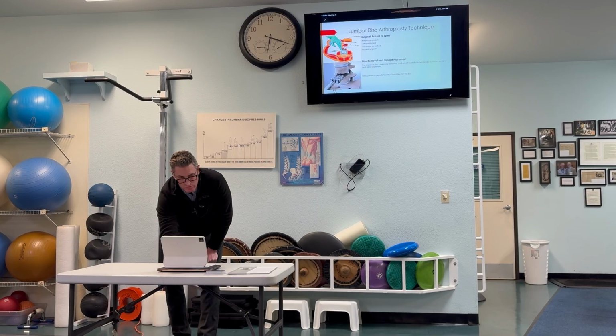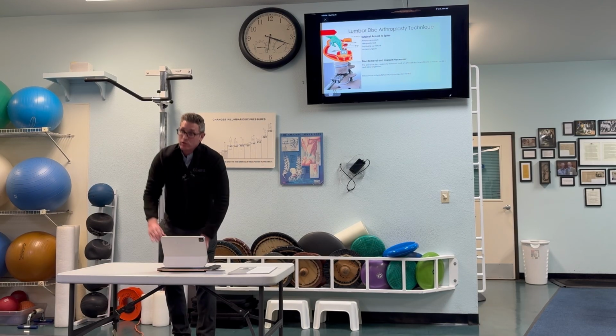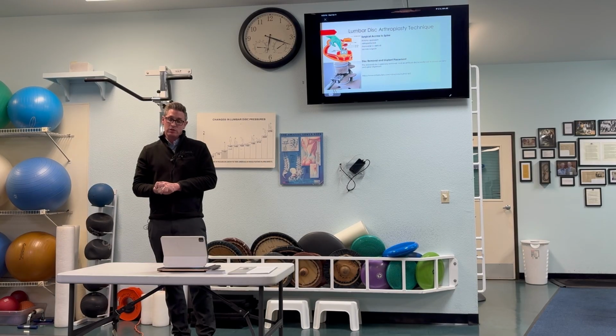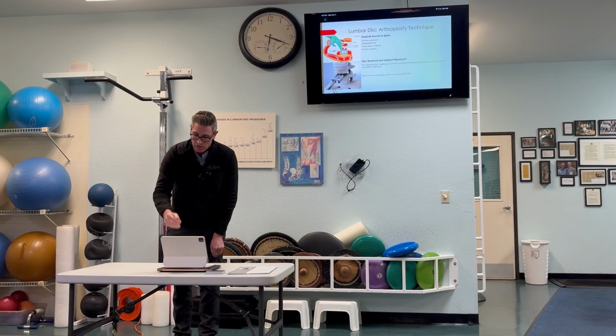So you can see that this again is a schematic of the surgeon mobilizing that peritoneum or the intestinal contents to access the spine itself, and then this is a cartoon of the implant of the disc replacement itself. So we want good visualization so that we can put our implant in the appropriate position, which is again confirmed with radiographic imaging studies intraoperatively as well.